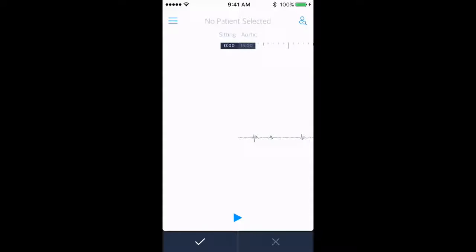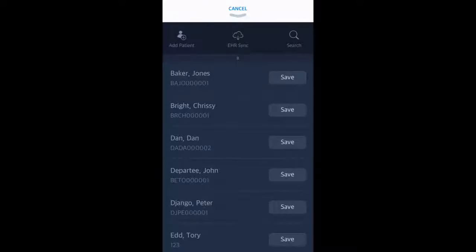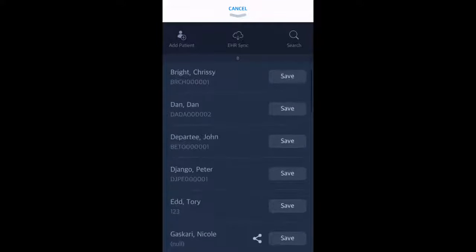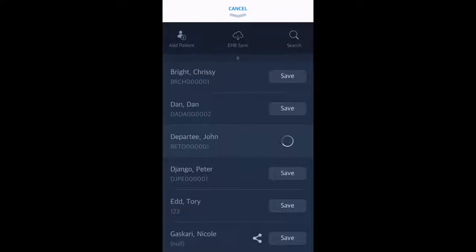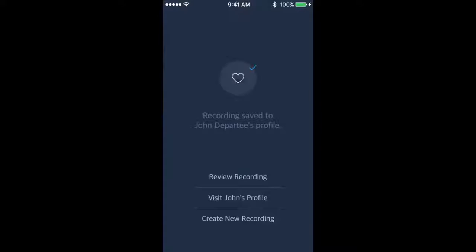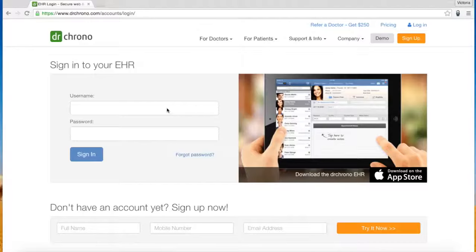You can now save your recording to the corresponding patient file. Notice that all of your patients have been imported from Dr. Chrono with first name, last name, birth date, and unique identifier.